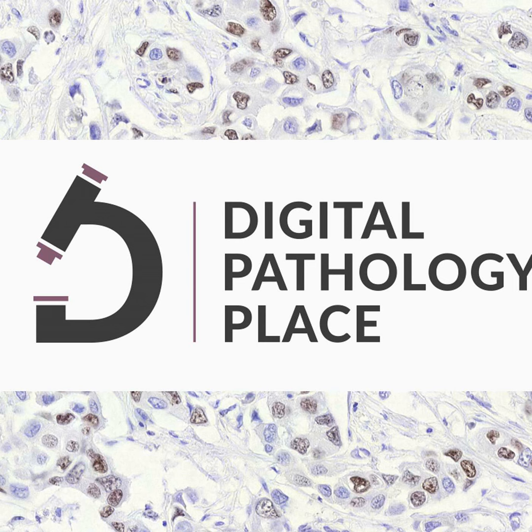Digital pathology has found its significant place in the arena of preclinical studies, fundamentally transforming the process of drug development. For animal model and toxicologic safety studies, digital pathology expedites the process of histopathological analysis, allowing for quicker assessment of the effect of drugs on animal tissues. This provides valuable insights about the safety and efficacy of new drug candidates, which are critical for deciding whether a drug should advance to the next stage of development.